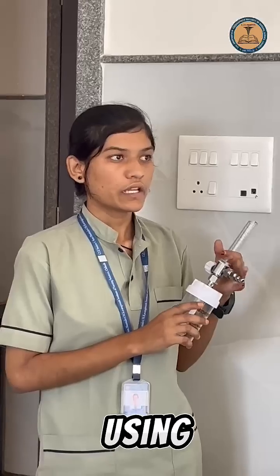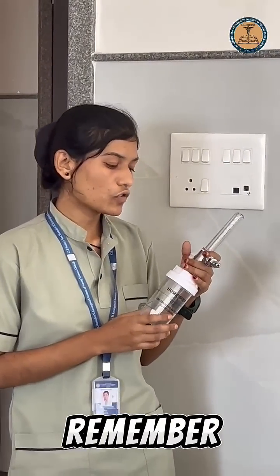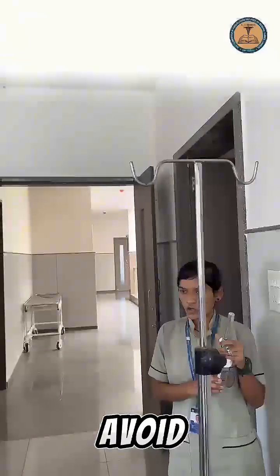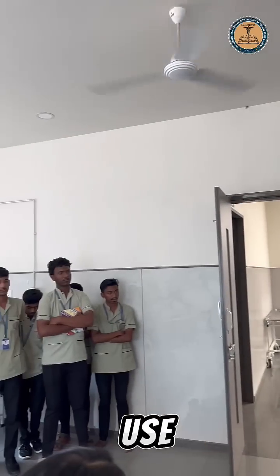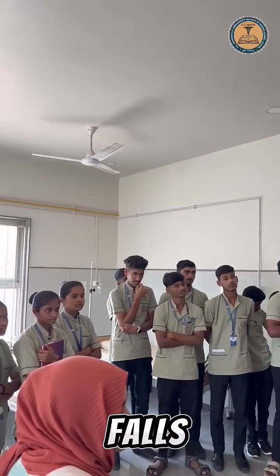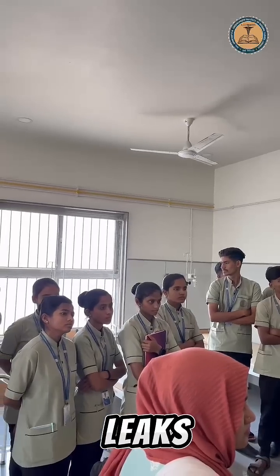Precautions. When using an oxygen flow meter, remember, never use oil or grease near the oxygen setup. Avoid sparks or flames. Always use clean, dry hands. Secure the oxygen cylinder to avoid falls. Check tubing for any leaks.